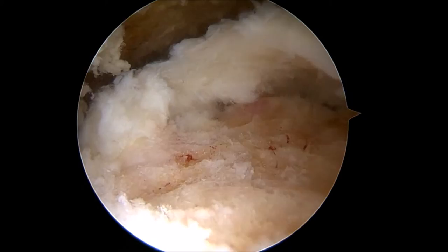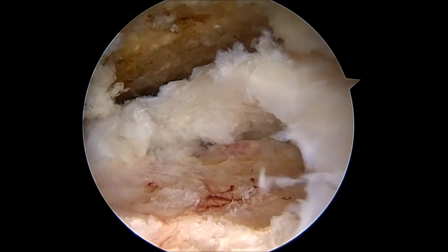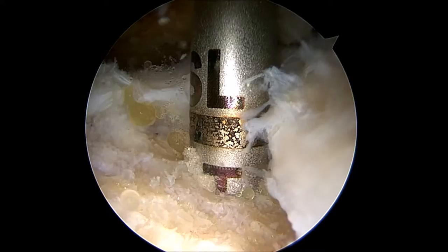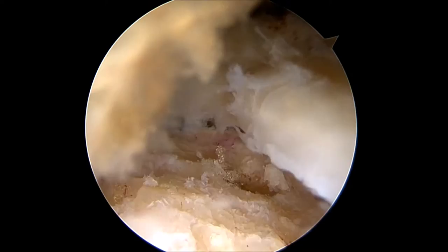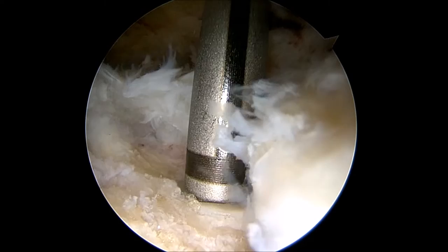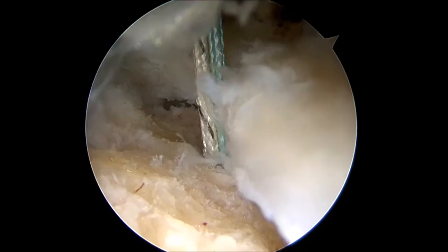Here you can see the prepared rotator cuff footprint which will serve as the attachment site for the rotator cuff after the repair is complete. There is a nice smooth bleeding bone surface. Next, an awl-type device is used to create a hole in the bone where a suture anchor will be inserted. The anchor is a screw that has suture materials loaded into it. The awl is removed and the suture anchor device is screwed into the socket. After the screwdriver handle is removed, you will see two white and two blue stitches which will be used to perform the rotator cuff repair. The screw is fully seated and the handle is removed.